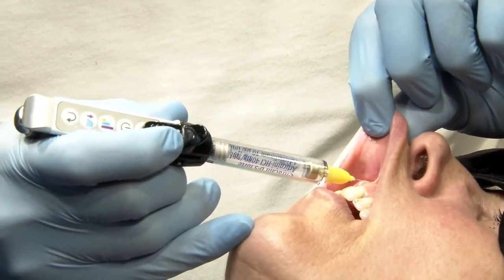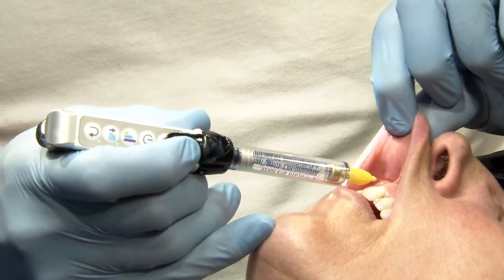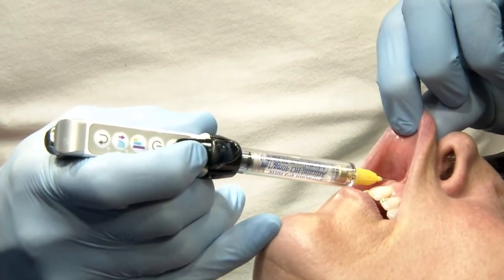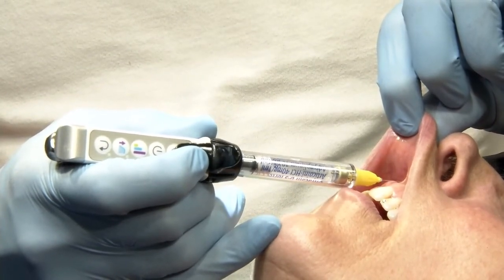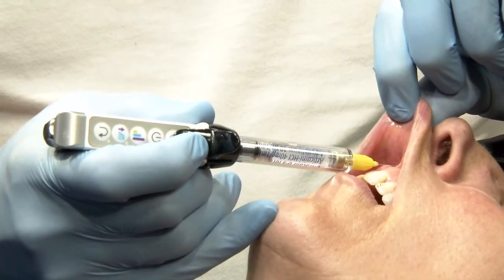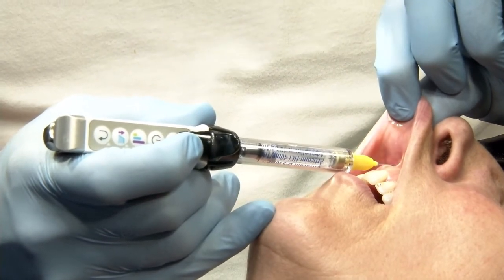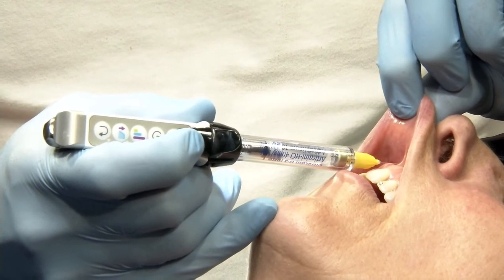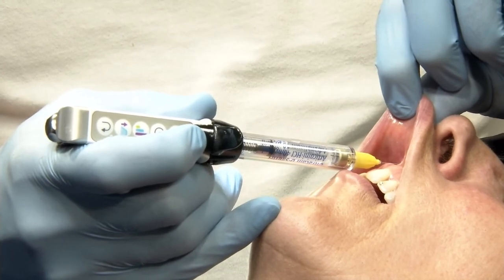We can see it really elegantly. I never had a problem in these nine months of clinical applications, so I don't have to move anything — the device is applying the anesthetics automatically. This is medium speed — actually a very slow setting.